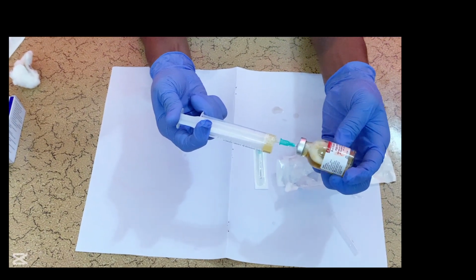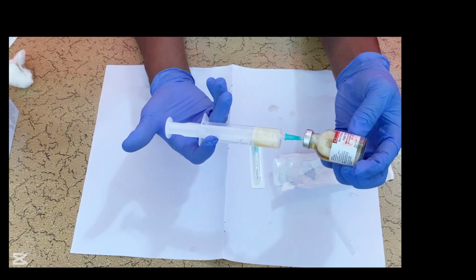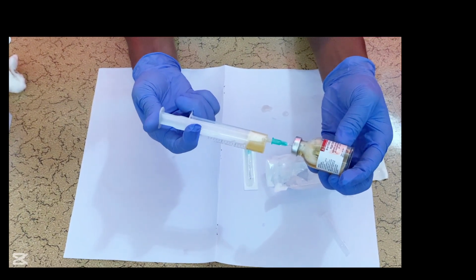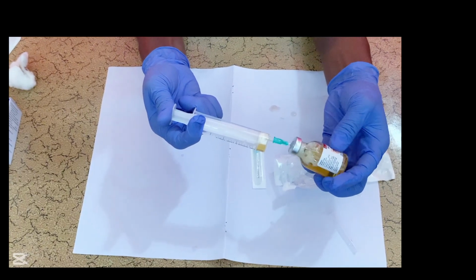Make sure that all the drug is completely dissolved. Then you allow air into the syringe. Then again you push the plunger gently to make sure you dissolve all the drug.